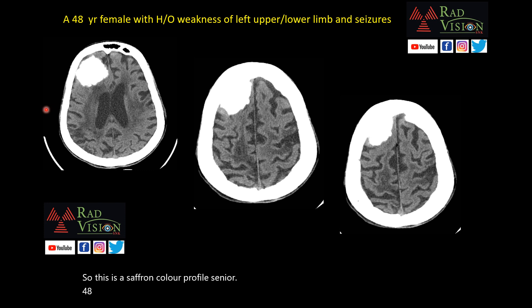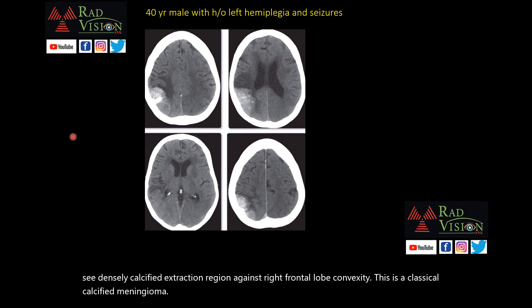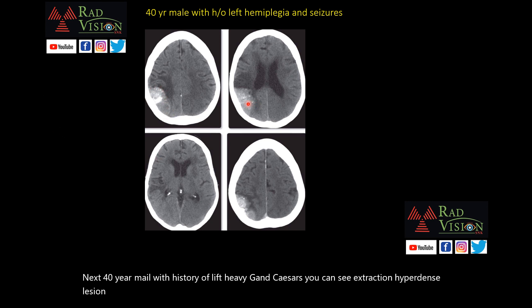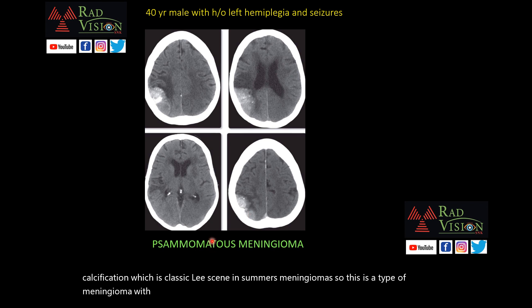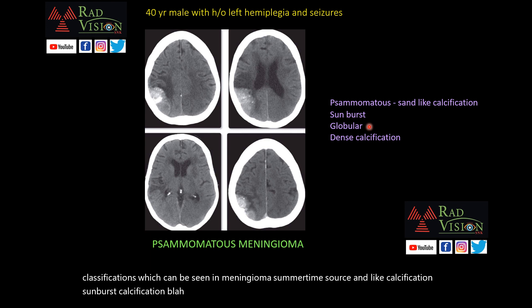A 48-year-old female with weakness of left upper and lower limbs and seizures: there is a densely calcified extra-axial lesion against the right frontal lobe convexity — a classical calcified meningioma. Next, a 40-year-old male with left hemiplegia and seizures: there is an extra-axial hyperdense lesion with multiple sand-like calcifications, classically seen in psammomatous meningiomas. Other types of calcifications in meningiomas include sunburst, globular, and dense calcifications.